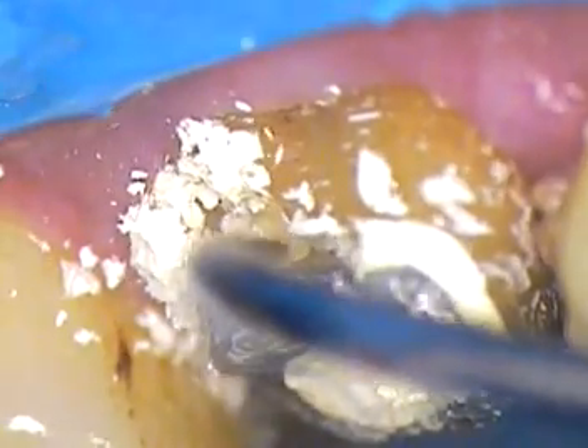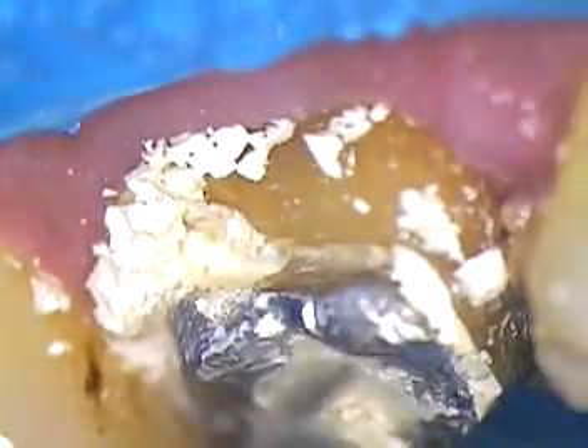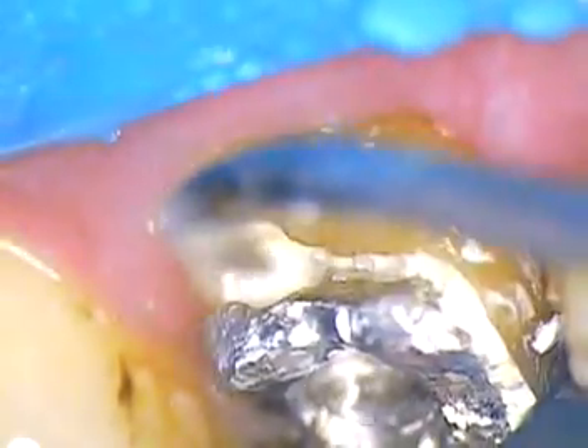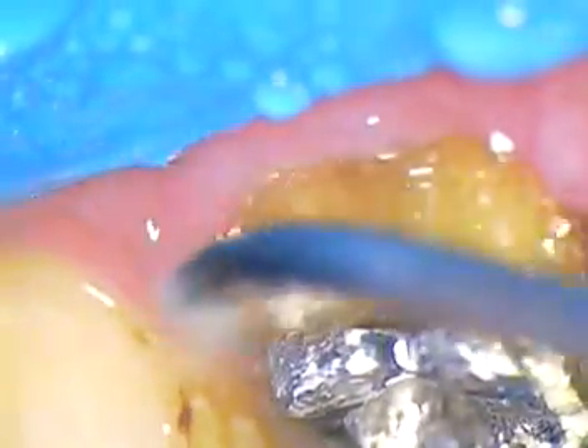So you can see how easy that is. Now look at how far in I'm going on this tooth — this was all tooth structure, most of which we conserved. We went into the metal with a fine diamond and tried to gain access. But the unknown we're dealing with here is, number one, this may be an amazing casting of non-precious metal, which is by far, as most dentists know, the hardest thing to grind on. We don't like it — I'd rather grind on titanium than this non-precious stuff.